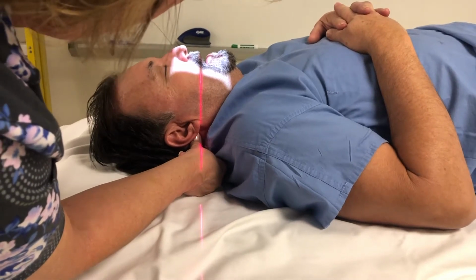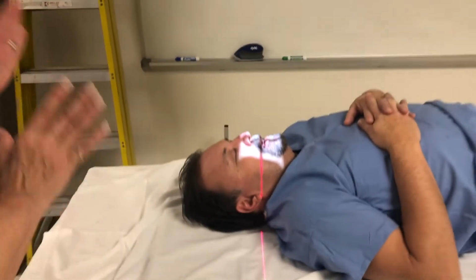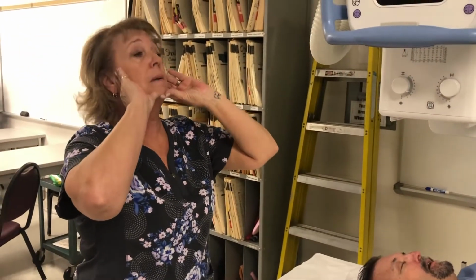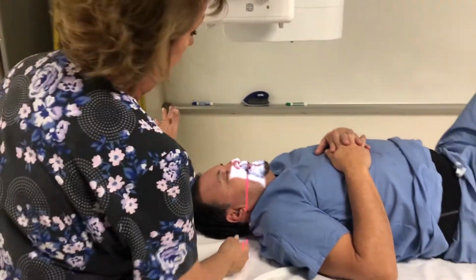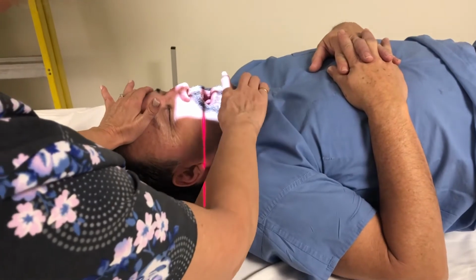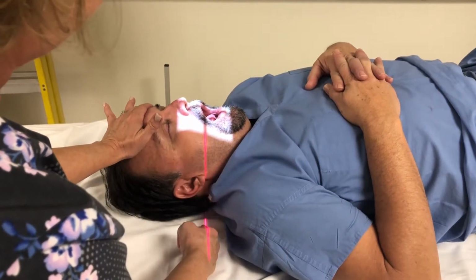Now the position that his head is in right now, I feel like is a good position for this patient. Sometimes you need to rock back a little bit, sometimes you need to tuck down a little bit. It's just until you get the occlusal plane lined up. And then from this point, I'm going to place my hand on his forehead and ask him to open his mouth as wide as he can. My occlusal plane is still perpendicular.